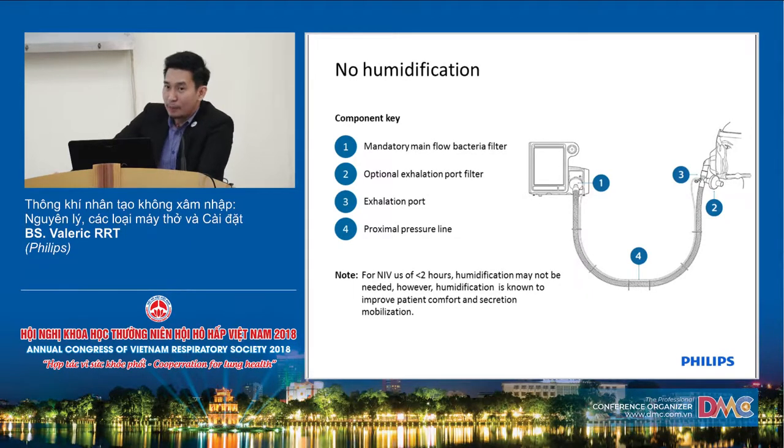According to this, if you're using non-invasive ventilation for less than 2 hours, there is no need for humidifiers. But if you notice your patient has a lot of secretions, from the beginning you can use active humidification to loosen up the phlegm. If the patient doesn't have that much secretion or phlegm, you can use non-invasive ventilation for less than 2 hours without any humidification. So this is the setup.